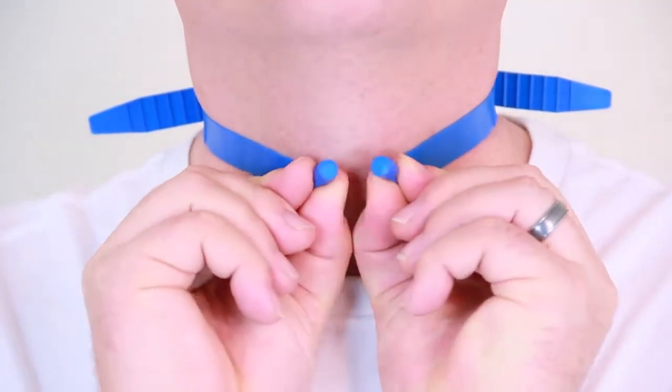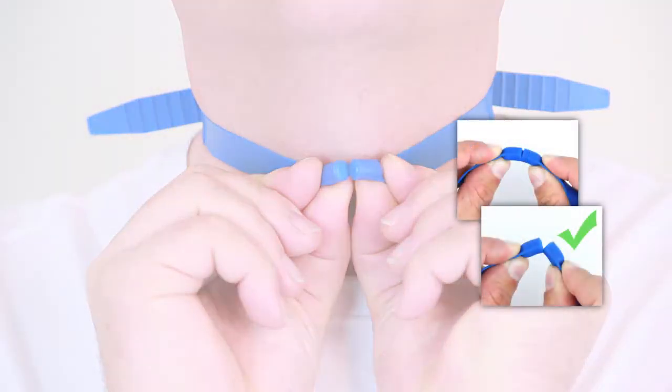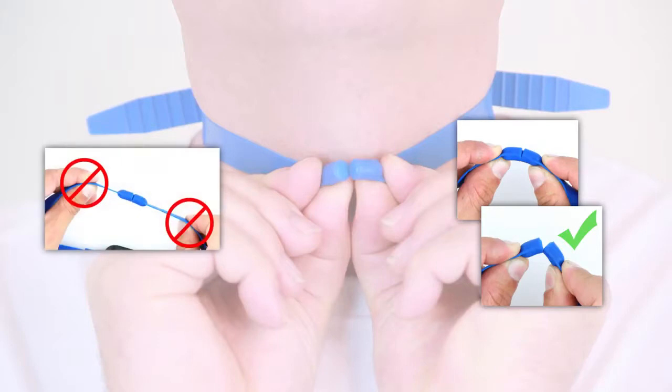Remove the Night Shift. When unclasping the strap, grasp each of the two magnets and bend them apart at a 90-degree angle, similar to snapping a stick. Avoid pulling the two magnets apart, as this may cause the strap to break.